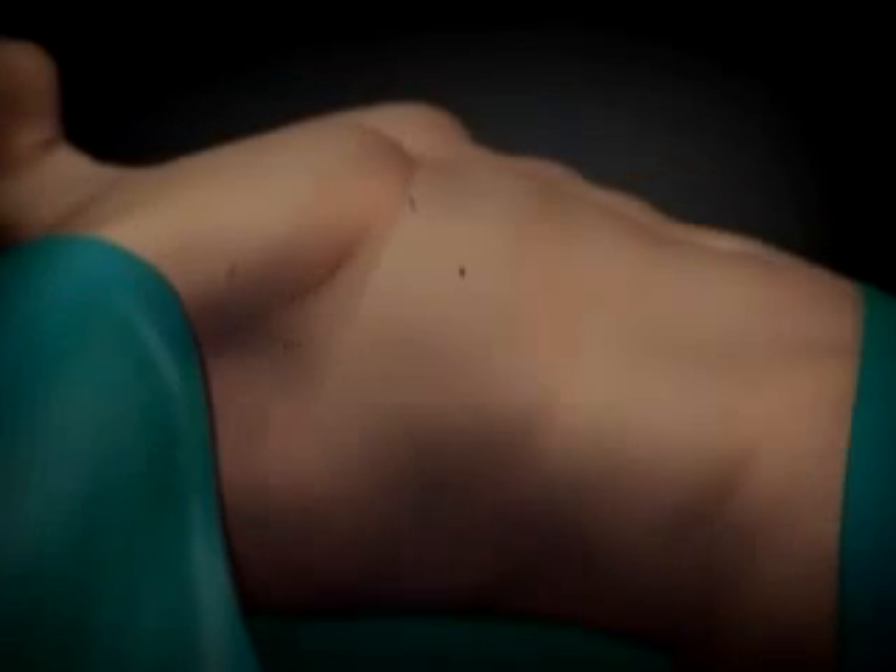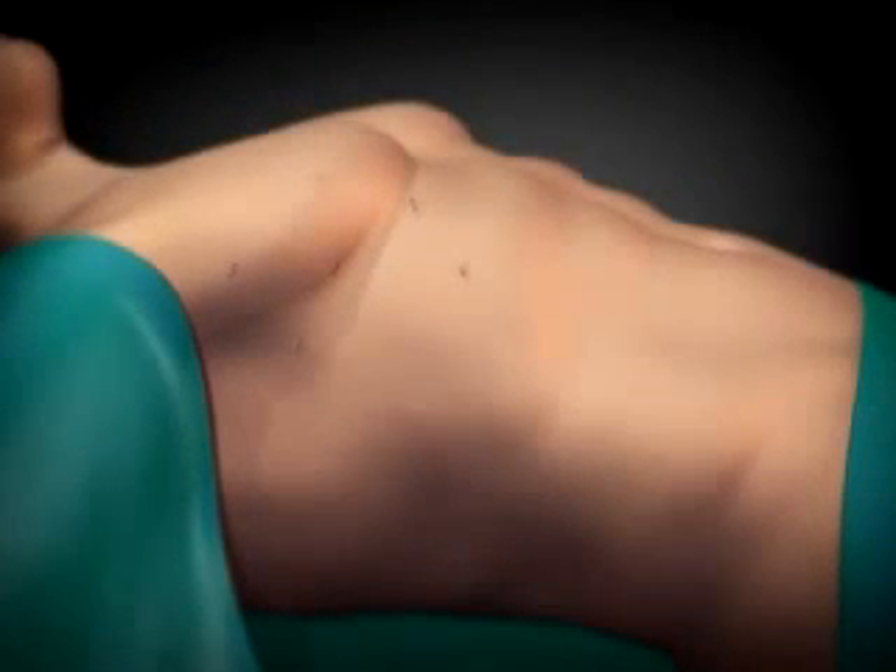After the procedure, only a few dime-sized scars remain, instead of the six to eight inch scar in the middle of the chest associated with open heart surgery.